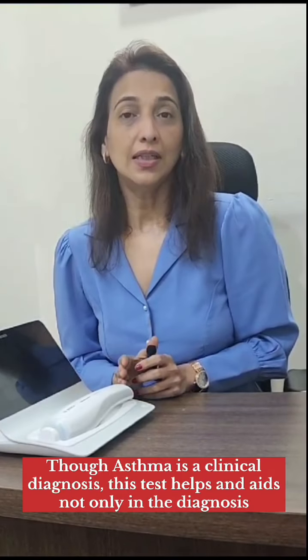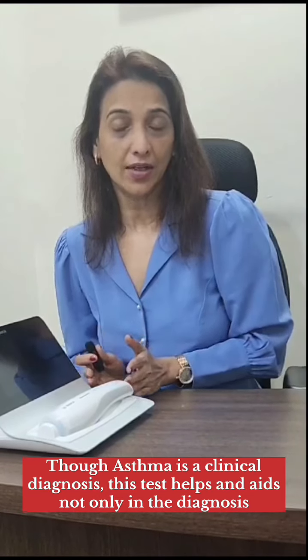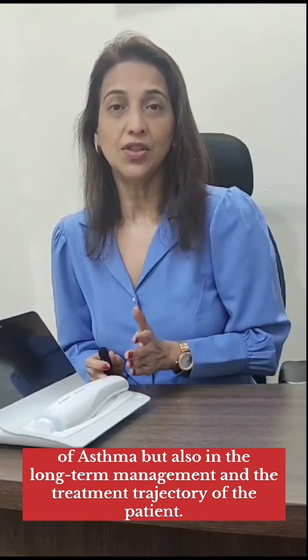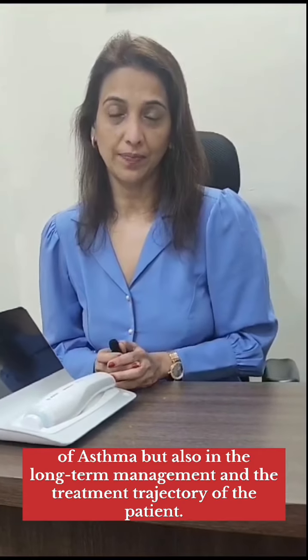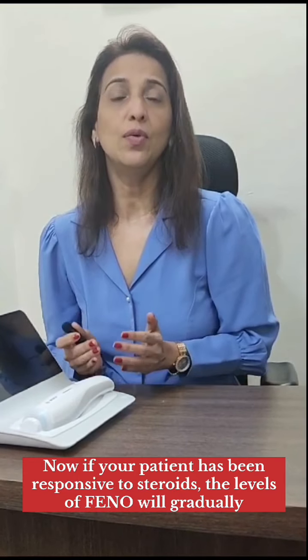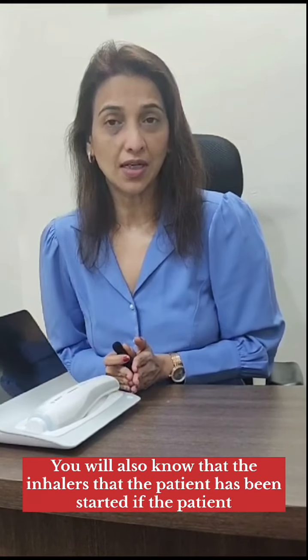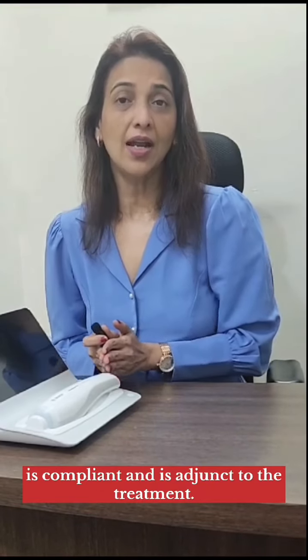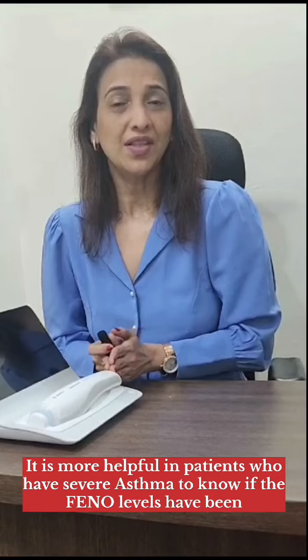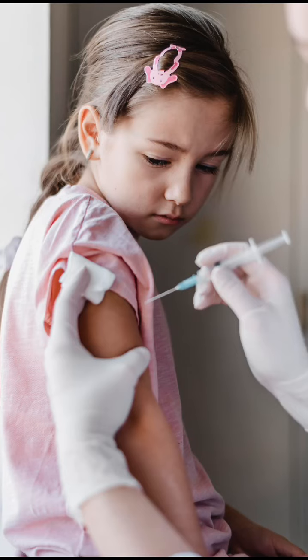Though asthma is a clinical diagnosis, this test aids not only in the diagnosis of asthma but also in the long-term management and the treatment trajectory of the patient. Now, if your patient has been responsive to steroids, the levels of FENO will gradually drop. You will also know if the patient is compliant with the inhalers that have been started. It is more helpful in patients who have severe asthma, to know if the FENO levels have been dropping after you have started the patient on steroids.